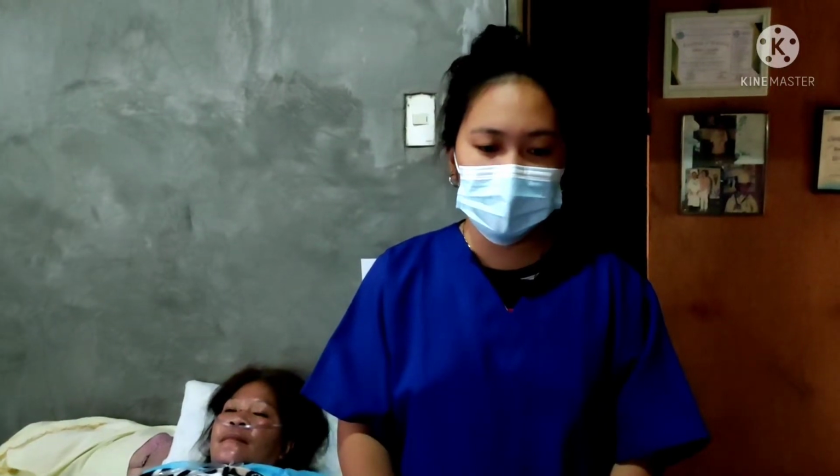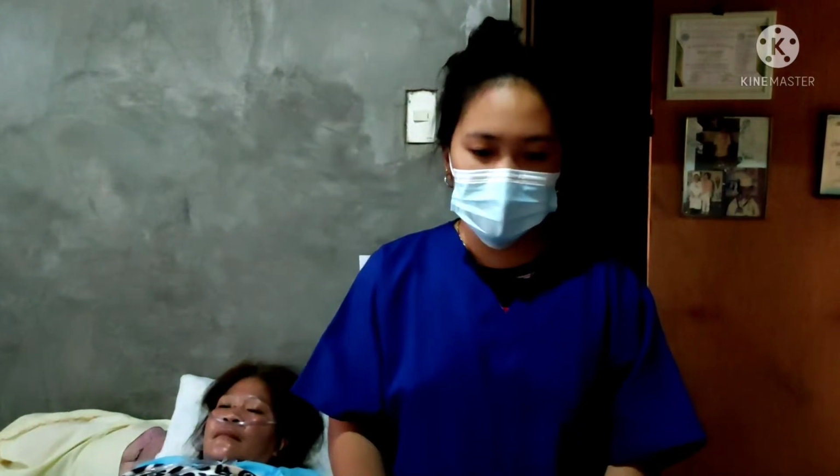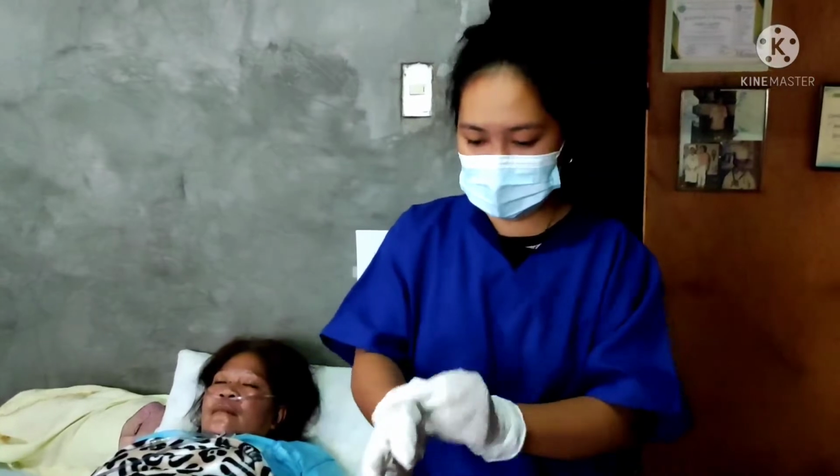The rationale of this: it identifies positive response to the suctioning procedure and provides an objective measure of effectiveness. Ensure the patient is in a comfortable position and the call bell is within reach. Provide oral hygiene if required to promote patient comfort. Clean up supplies, remove gloves, and wash hands. Document the procedure according to hospital policy.